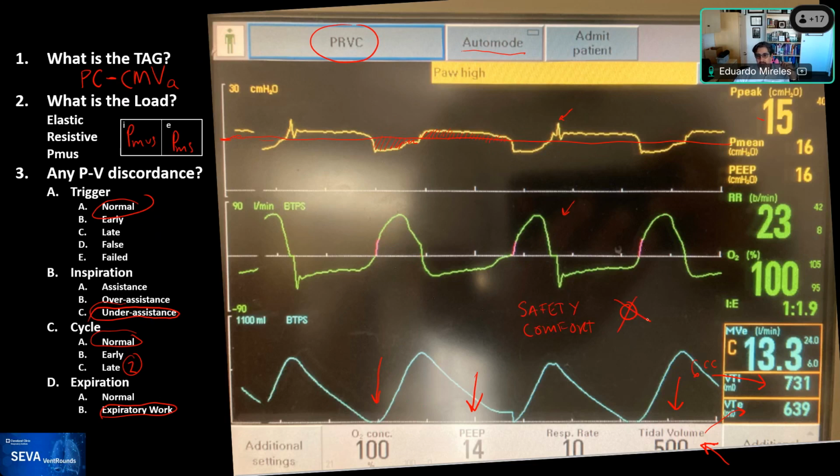So this is one of those ventilator screens that you have to stop, deal with it, change the patient to pressure support while you figure it out, and then decide sedation, paralysis, so take away the pain. I mean, there's a thought process here that you need to come to help this. Yeah, not meeting any goals. Absolutely, Raquel. All right, Rob, any closing comments on this one? Yeah, this patient's worse off than if he wasn't even connected to a ventilator. He's just on CPAP, right? Yeah, absolutely.